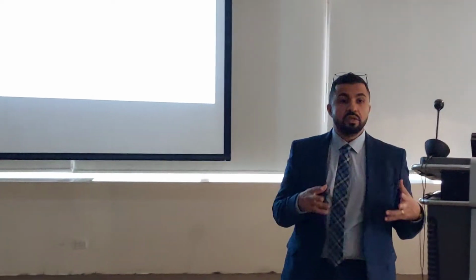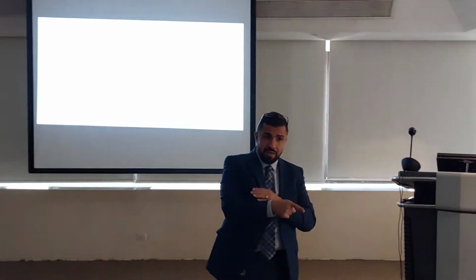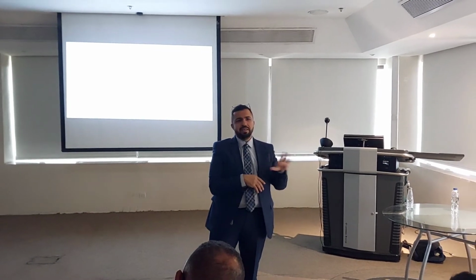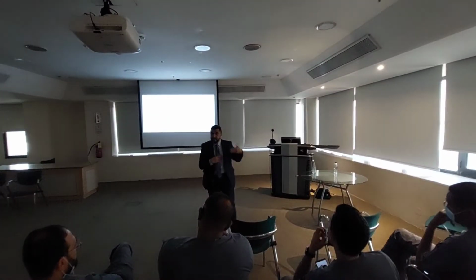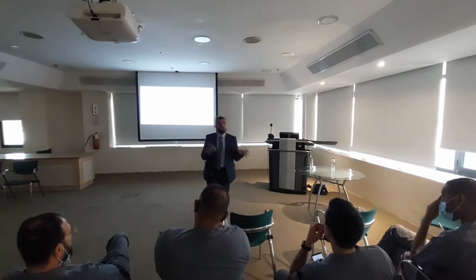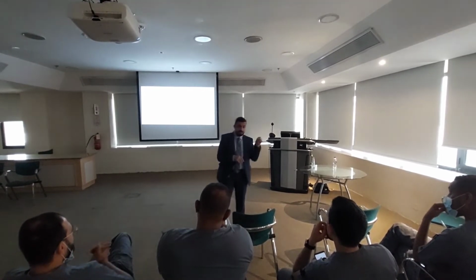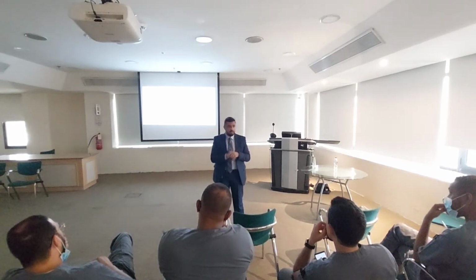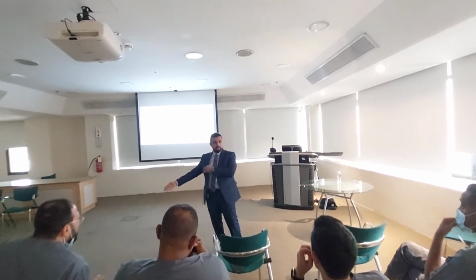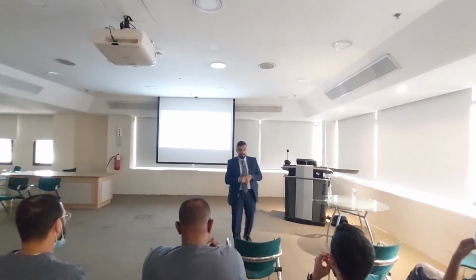You get that? That's why, if the doctor thinks this is a normal patient, I may not need any treating cath lab. I will not be intervening, I will not be stenting, I will not be ballooning. So he knows that this patient is a good candidate for cardiac CT scan. If your patient is already diagnosed, it's not okay to do cardiac CT scan, because you will do the cardiac CT scan, and then you will transfer him to the cath lab. So you did both. That's not the case. You get that? This is the way.